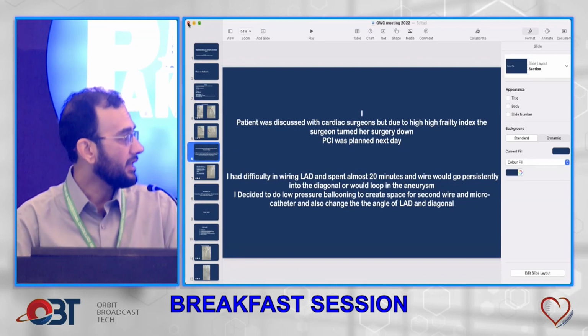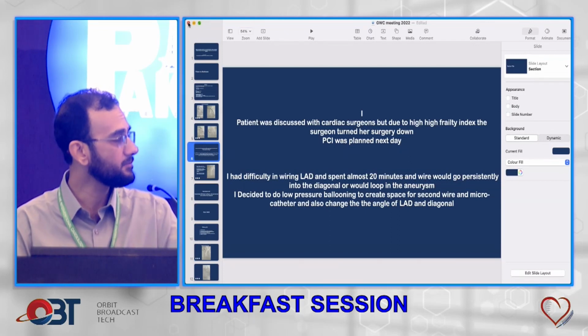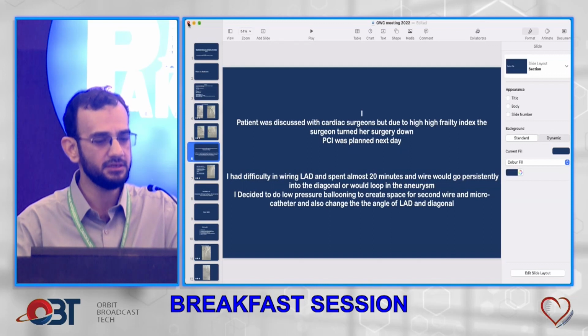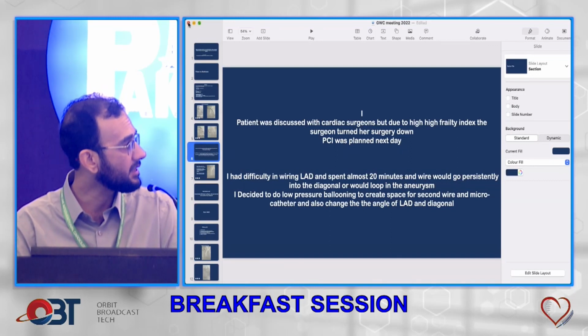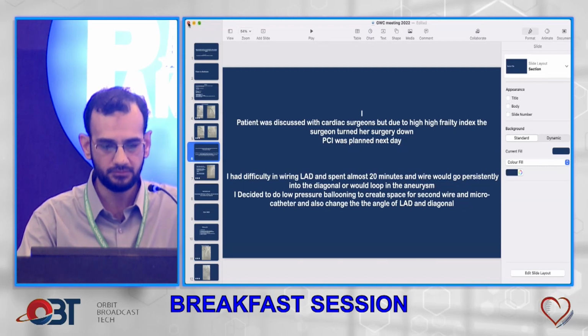The ejection fraction on echocardiogram was normal without any significant valvular abnormality. So in view of persistent symptoms, we decided to go ahead with PCI. These are the pilot shots from an EBU 3.5 guiding catheter. The caudal view here shows a tortuous circumflex system without any significant disease, while this ostial severe LAD osteoproximal disease is evident, and the cranial view confirms a moderate to severe disease after a good-sized diagonal branch.